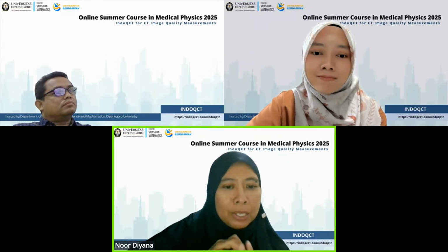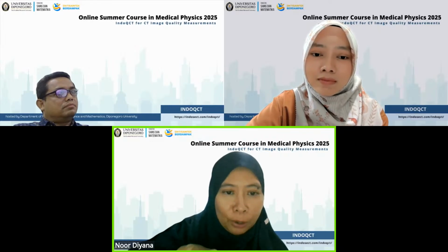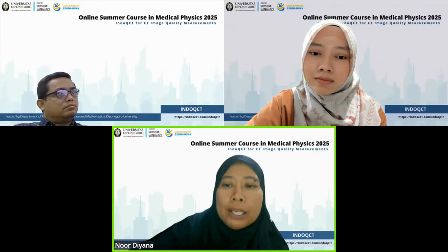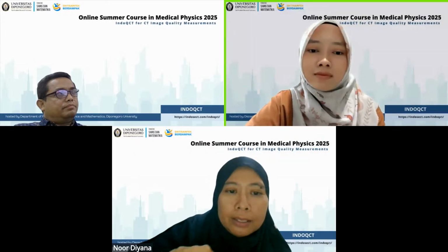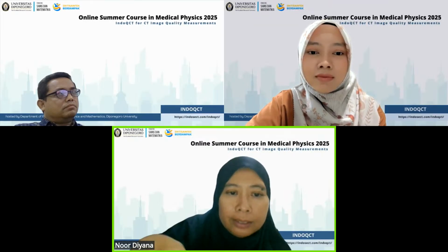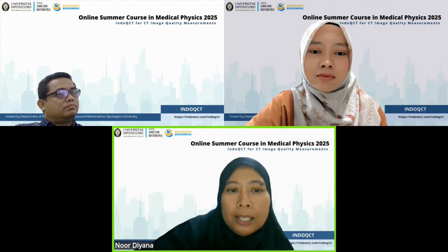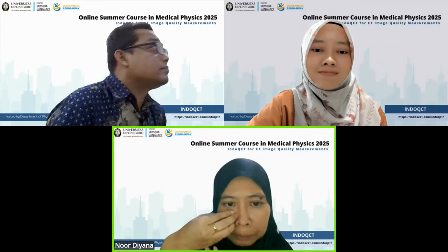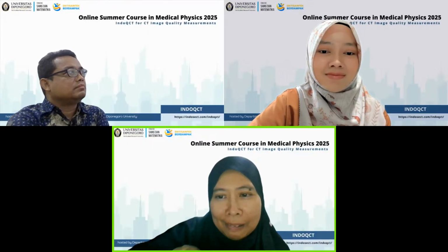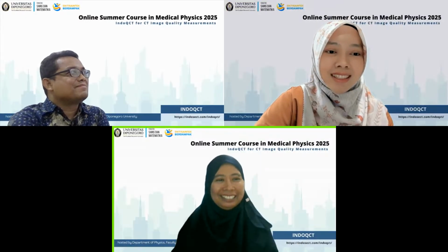As mentioned by Dr. Anam just now, for PSF, it usually depends on the noise. So it's a fluctuation in the situation that affects the PSF measurement. For the edge, you should have an object with a sharp edge, so it will give you a better edge MTF. Those are the factors affecting the PSF and the edge. Maybe Dr. Anam can have another comment.